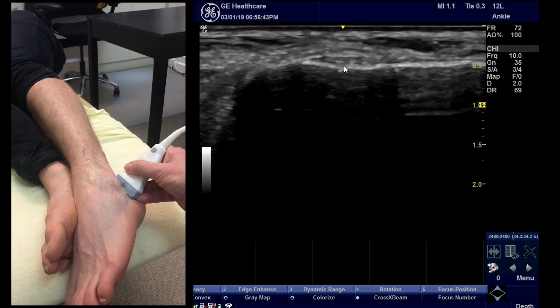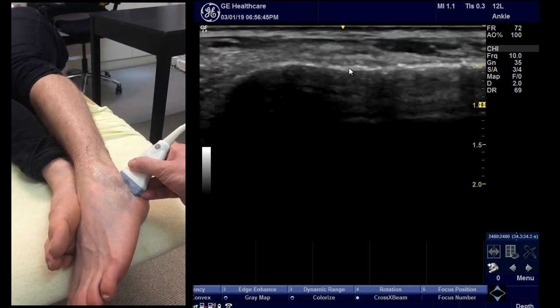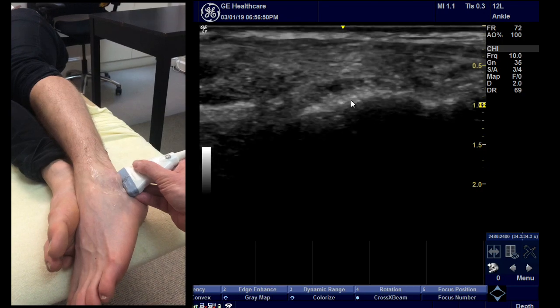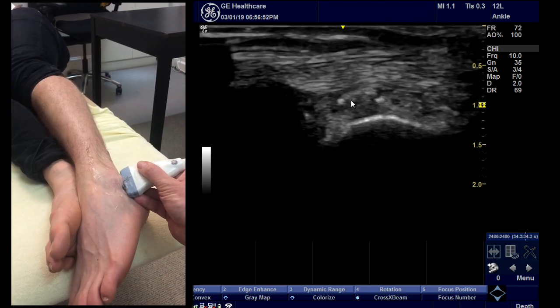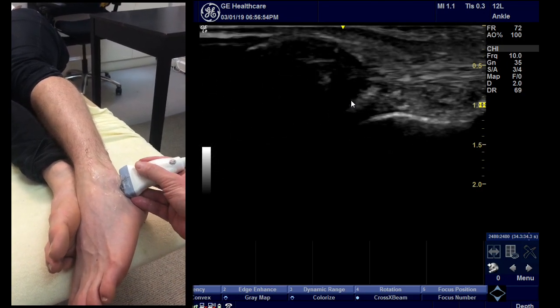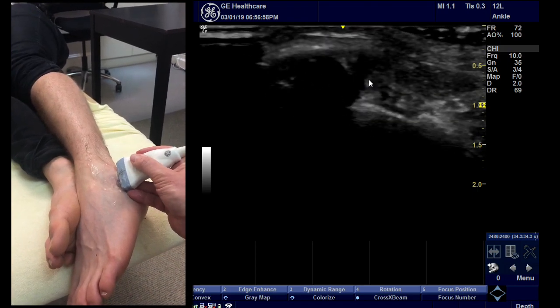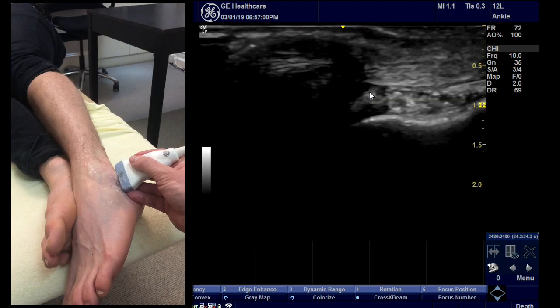It flattens out and inserts in this region onto the calcaneus. You can follow it back up under the tendons, and if you angle carefully you can sometimes see it insert just there on the base of the fibula, which is less well seen at those angles.